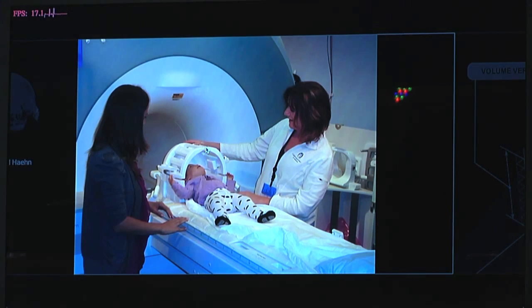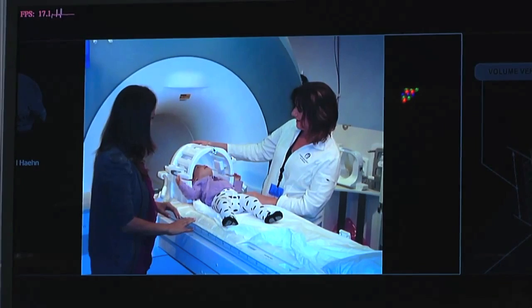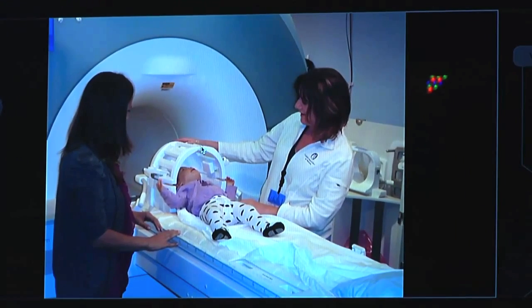The coil enhances the signal-noise ratio very much. So she lays underneath there to get better contrast, better imaging contrast. So MR works like with a strong magnet, which stimulates the molecules of tissue, and due to different relaxation times of the tissue, we can map it to intensity values of like an image.